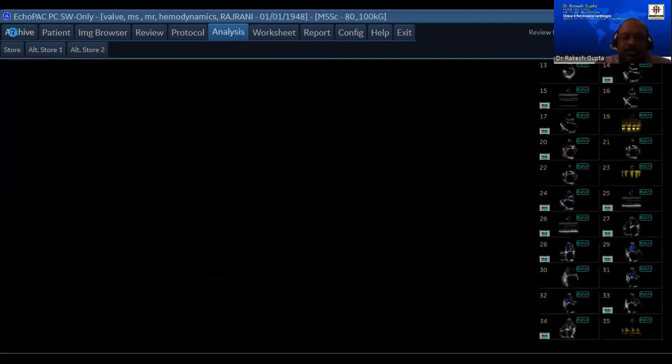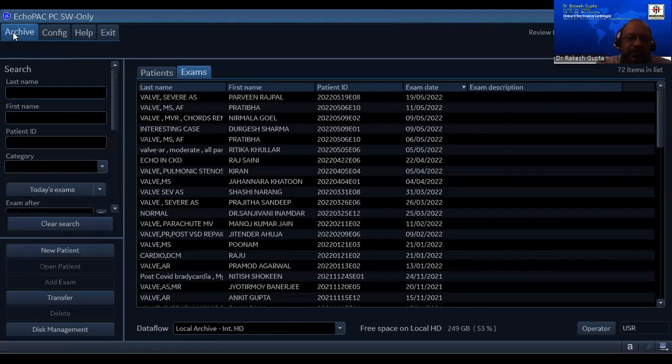Anybody, any other questions before we go to aortic regurgitation? Sir, can you please repeat about MAVIR? MAVIR is nothing else, mitral aortic velocity integral ratio.